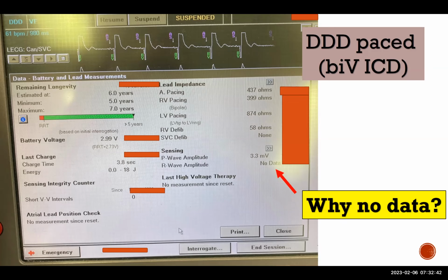That's because we really only need it to be able to sense intrinsic activity. But for defibrillators, we want it to be able to sense not just regular PVCs, but even fine ventricular fibrillation. And so defibrillators are always programmed with a sensitivity that is much more sensitive in the ventricle than our pacemakers. Okay, so in this case, we would just go with the default one that the manufacturer gave us. Might not be right, by the way. It's always a concern, always a risk, but that's what we would do.